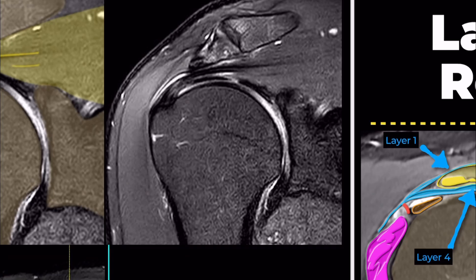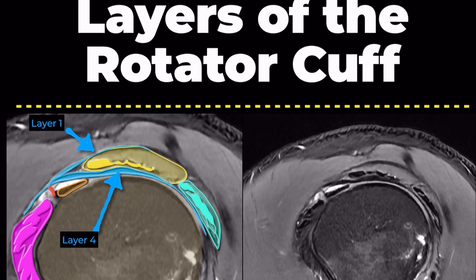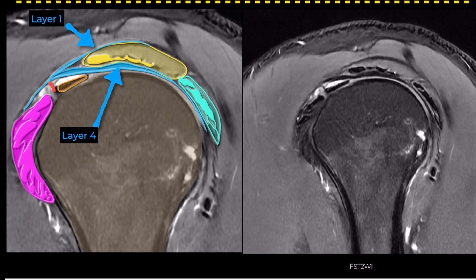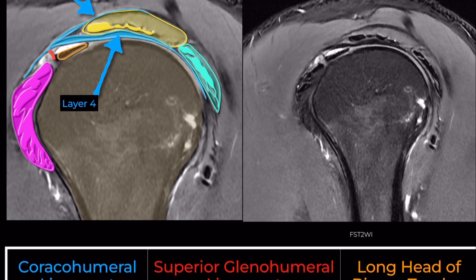On sagittal images, the coracohumeral ligament has two extensions which are best visualized. Layer 1 — Superficial Limb: this courses along the bursal surface.